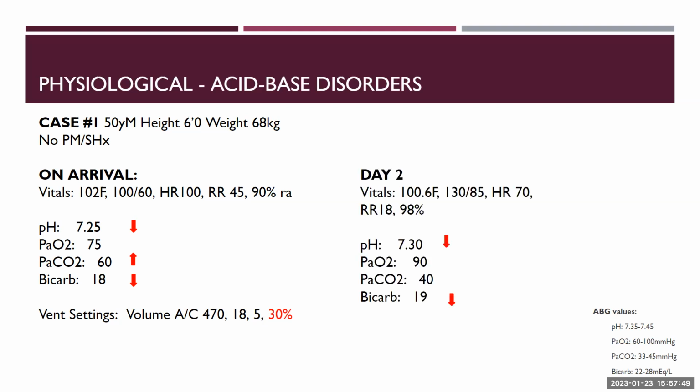So let's say we get to day 2 and these are the patient's vitals, and we've taken him off of the vent. Looking at this, would you want to add him back on the vent? Do you think this is necessary, or how would you want to move forward with this patient on day 2 now being off?